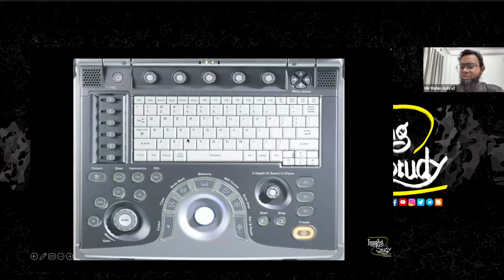The machine has several parts. There is a freeze button, which we use to freeze the image or make a live image, or real-time mode. There is a trackball over here, which is used as a mouse. And you know the mouse has right and left buttons. Here we have set, select, enter type buttons. There are some measurement options like measures, caliper, calculation, distance, many names.